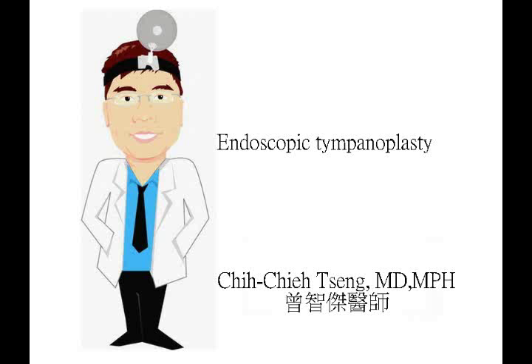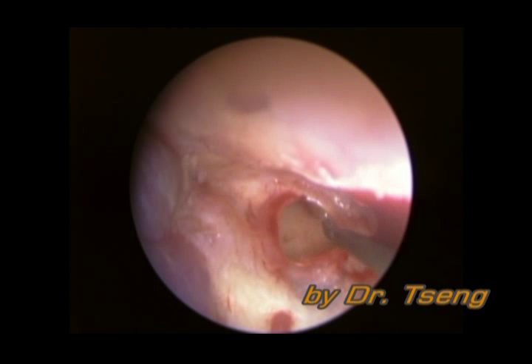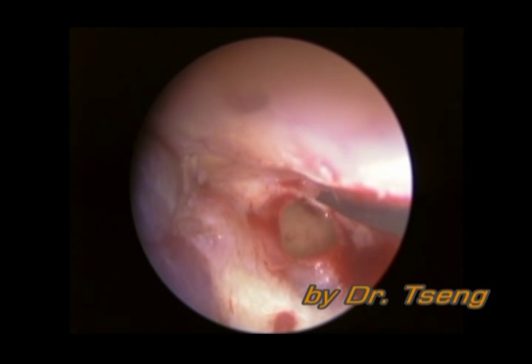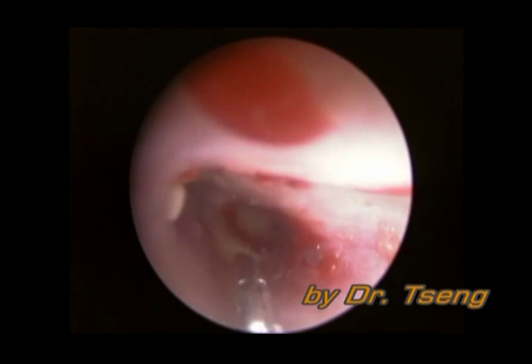In the following video, we will introduce the procedure of endoscopic tympanoplasty. The operation was performed under local anesthesia. It is an outpatient procedure. The patient walked out of the operation room and went home after surgery.